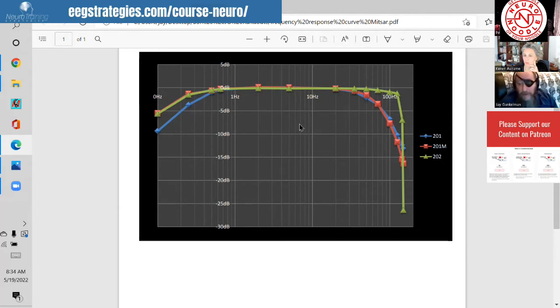So electrode systems are critical, not just the amp. The software that you're feeding it back with is critical, not just the amp. But it's astounding the changes in the amps over time. I can show you dry sensor technologies that have fabulous amplifier responses, but the difficulty with them is the skin contact. You know, if you have a jitter on the skin contact, the amp might be linear, but your signal is terrible. So you have to have more than just the technical detail of the amp, but the amp itself is the base that everything else has to be built upon. And so getting the amp right is critical.